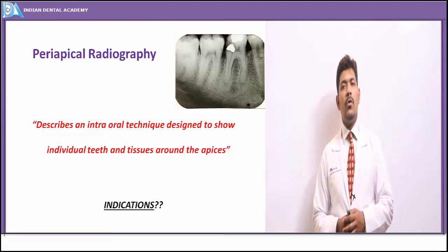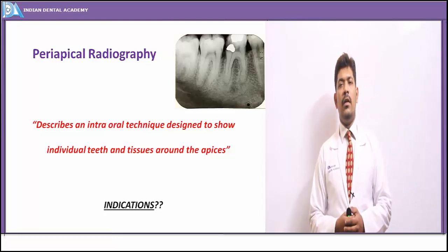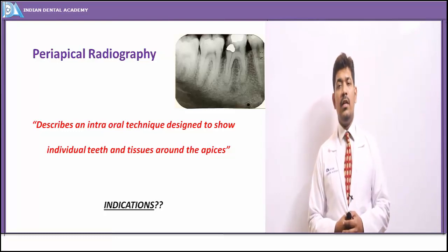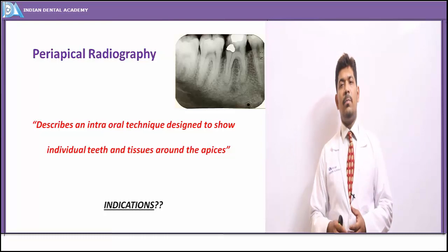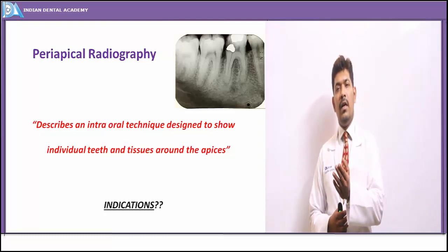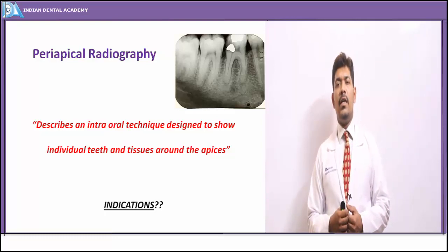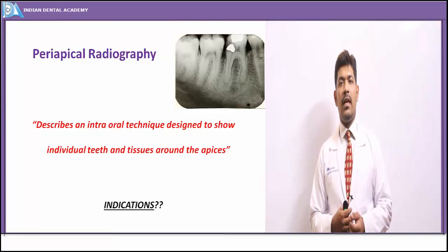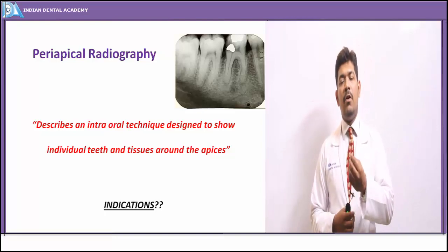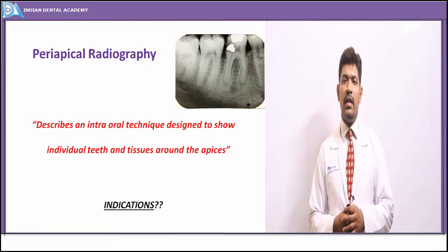The most common problems a patient presents to the dental physician are related to the periapical region, be it common caries or the common sequelae of caries. The periapex of the tooth plays an important role, and the radiograph which can give information of this periapex is the most important aspect for a dental physician.